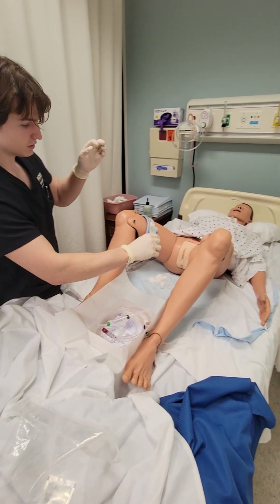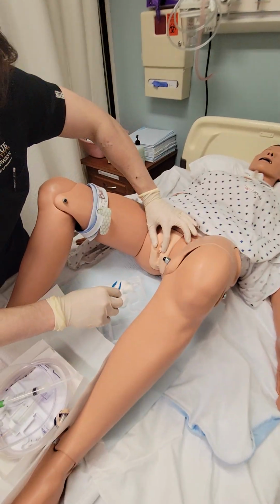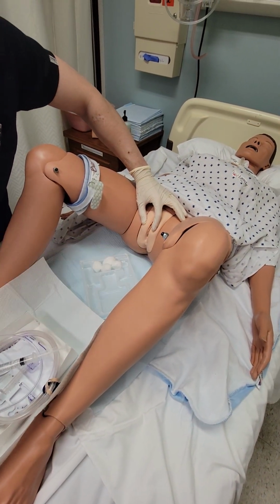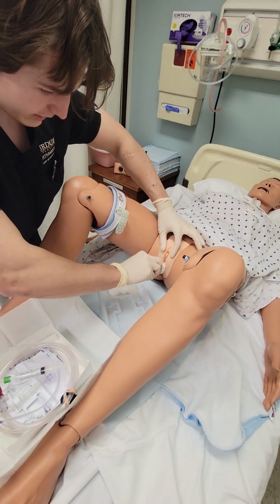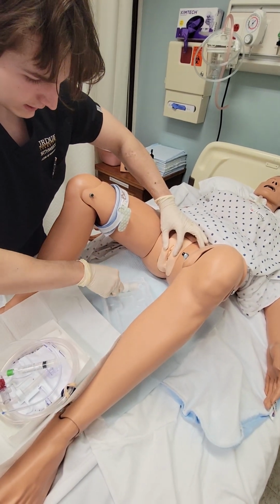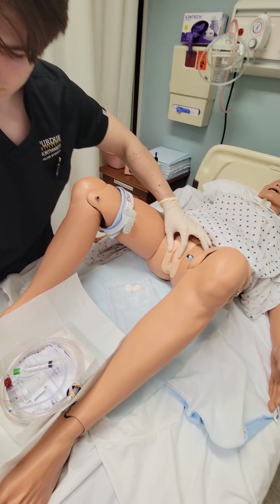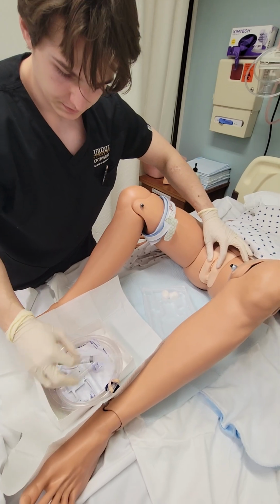Right, so I will spread labial folds, take a cotton ball, side, toss, side, toss, and then down the middle. I can go way too now.